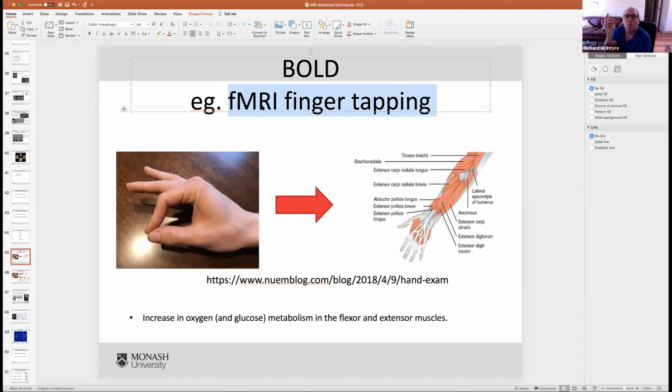While we're scanning, what's happening? Our muscle is using oxygen, okay, more than any other muscle. I've got to think about this. My right muscle is using a lot more oxygen, the extensors and flexors in my muscle, than my left, okay? I had to think about that because I'm looking at myself, which I shouldn't do. That's very vain. So my extensor muscles are using more oxygen in my right hand than my left hand. Okay.